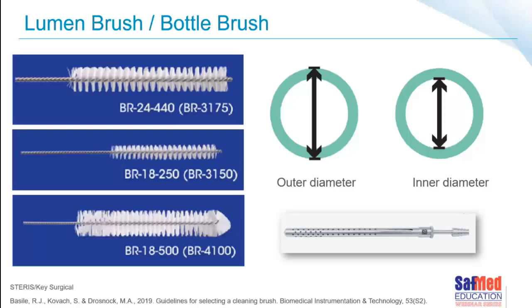For other suckers, of course, we're looking for a brush that can pass all the way down the lumen, and we don't necessarily need something with a fan tip. So it's important to understand the brush for the particular lumen that you are looking at.